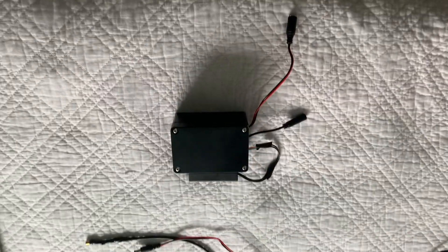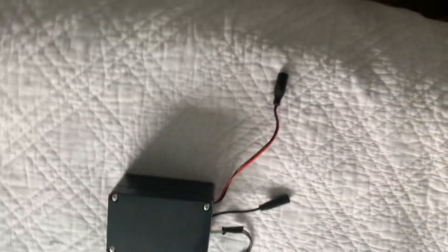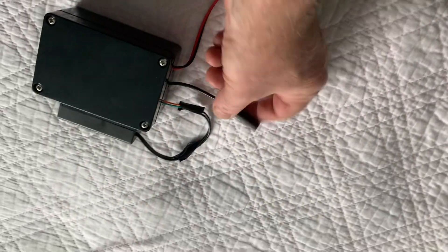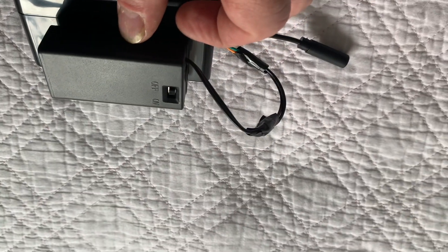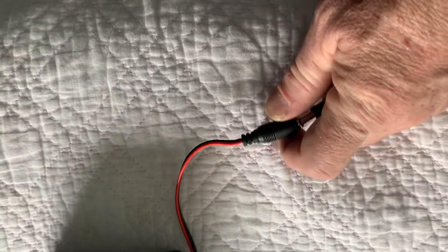This is the switch-adapted laser pointer. This is the actual laser right there, and you can just plug it right into there, then plug any switch into that. This is where the battery operates and you can just turn that on and off.